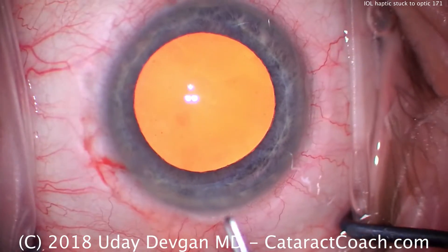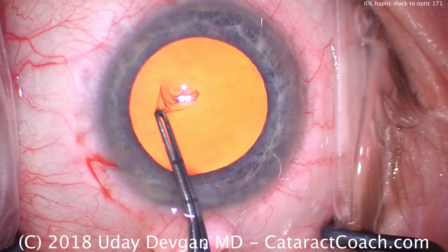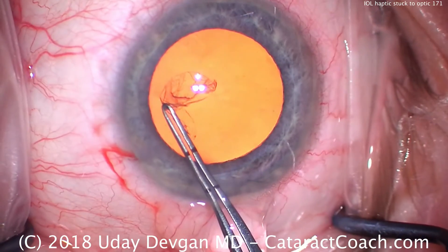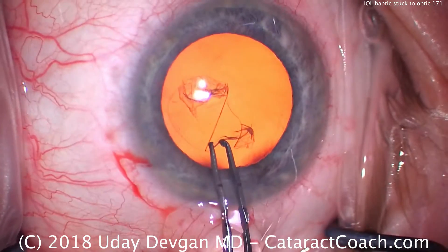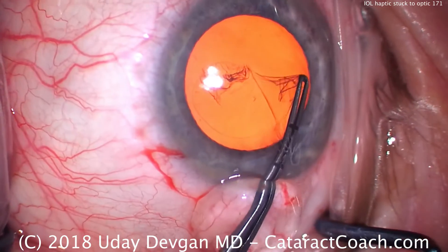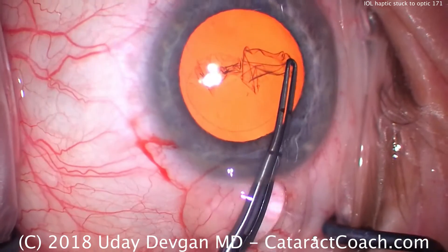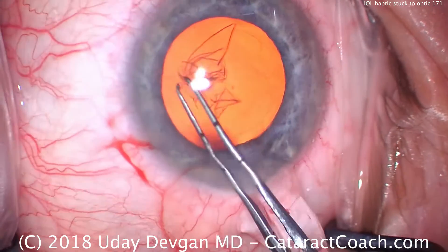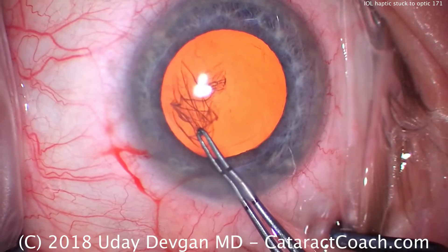We're going to do our capsulorhexis as well. These are my forceps marked off at two and a half and five millimeters, so we can measure and continue the rhexis. That's going to allow me to create an ideal capsular rhexis because I know what's the appropriate size — I want five or five and a half millimeters, somewhere in that range. I want it to just barely overlap the optic of the lens for 360 degrees, and I want it round and well-centered in the eye.